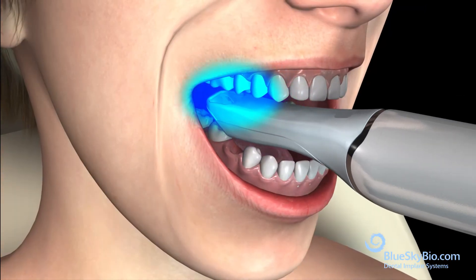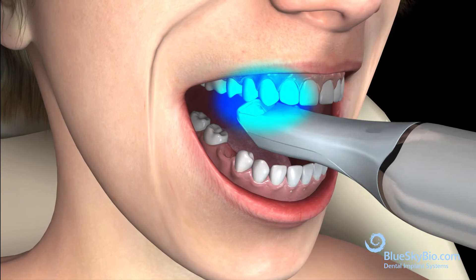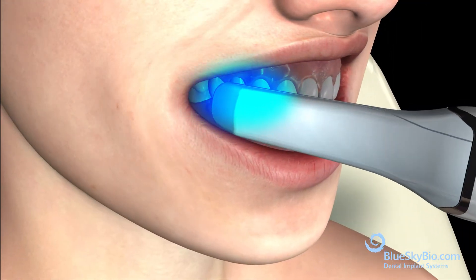Scan the teeth of the opposite arch. Then scan the buccal surfaces of the teeth in occlusion.